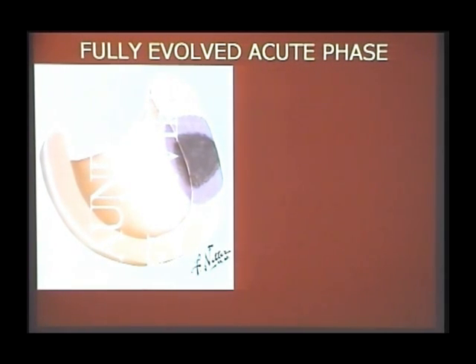The some area surrounding that, the central core area, continue to remain in injury. It is not gone in for an infarction, it has not recovered. Whereas the periphery area, that is periphery territory, will recover from injury because of the collateral circulation which is coming and go to the previous stage of coronary manifestation of ischemia. So what happens in early hyperacute, in fully evolved acute phases, there is a central area of necrosis, surrounding area of injury and peripheral area of ischemia. So this is a very important stage because here is the only stage in which you see all the three manifestations of coronary heart disease.